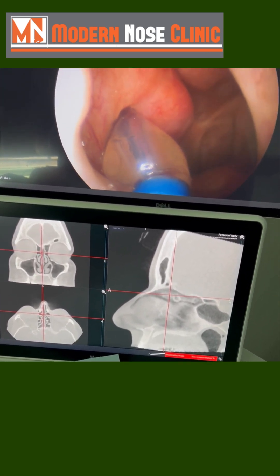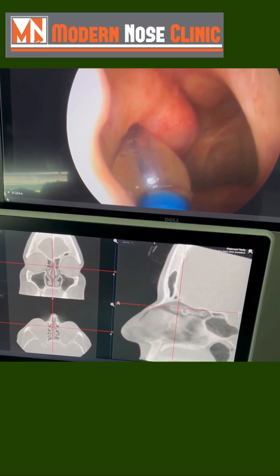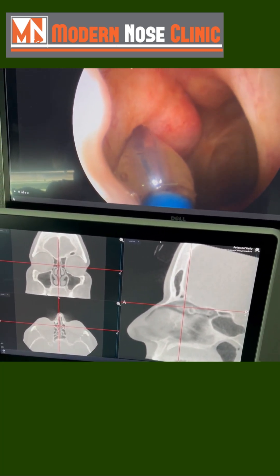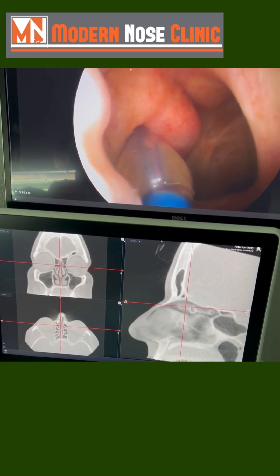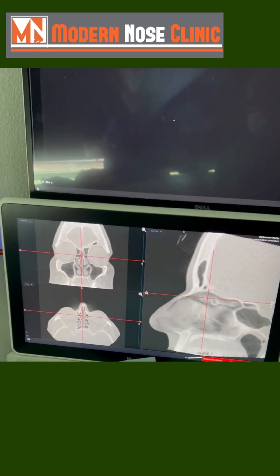It's 12 atmospheric pressure. The balloon is 16 millimeters in length, and there is a safety device on the tip. You can see your soft palate moving. Deflate — do that for two minutes. That's it, and that's the story I'm sticking with.